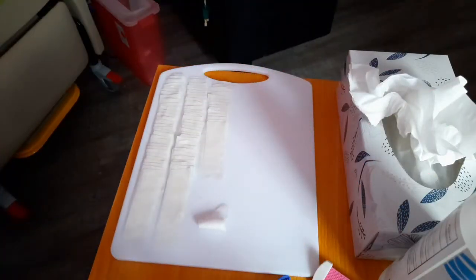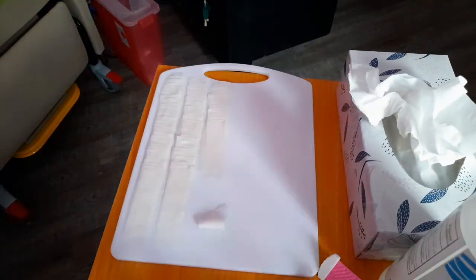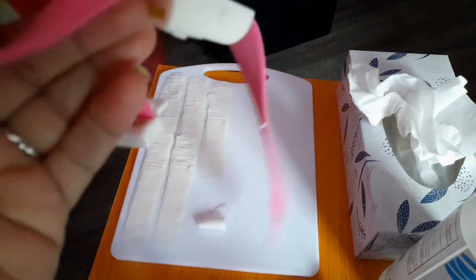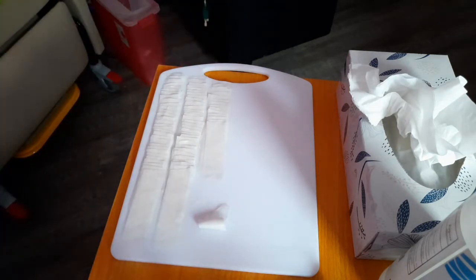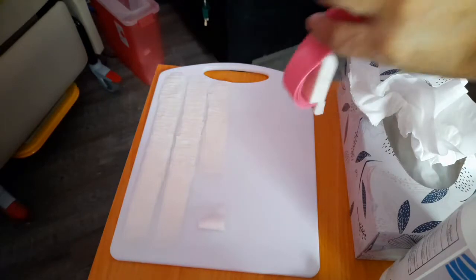Okay, so to prep, here's what you need. You need to get your gloves out. You need to get your tourniquet out and ready. So, go ahead and do that. My tourniquet is ready to slide up my arm. I've got that done.